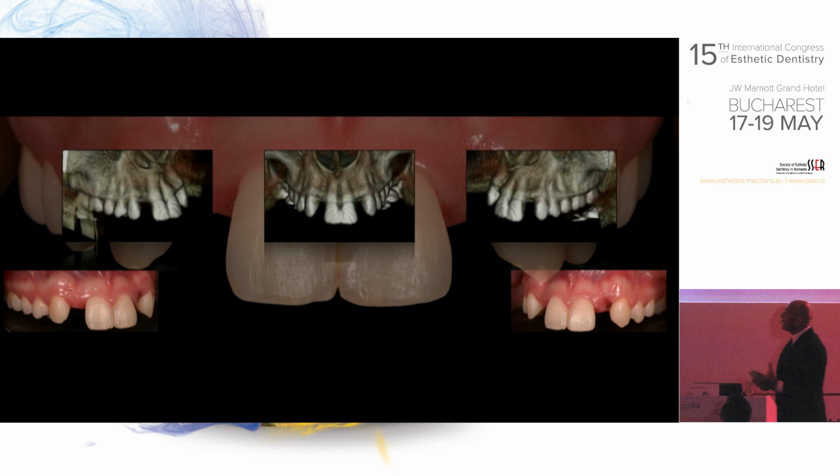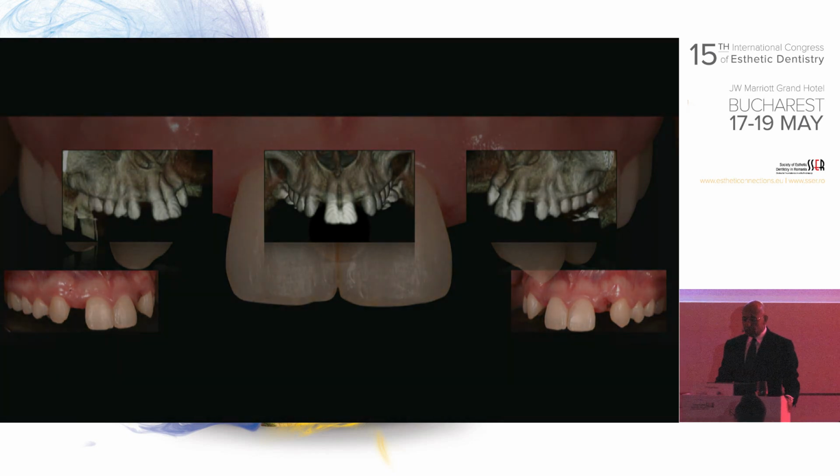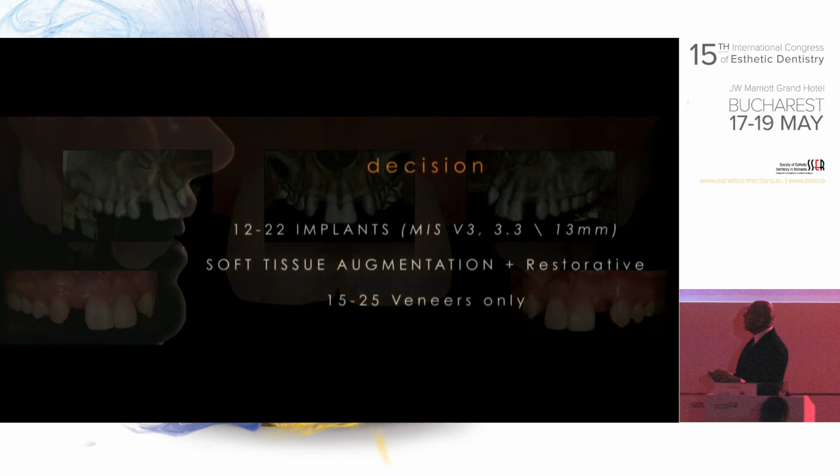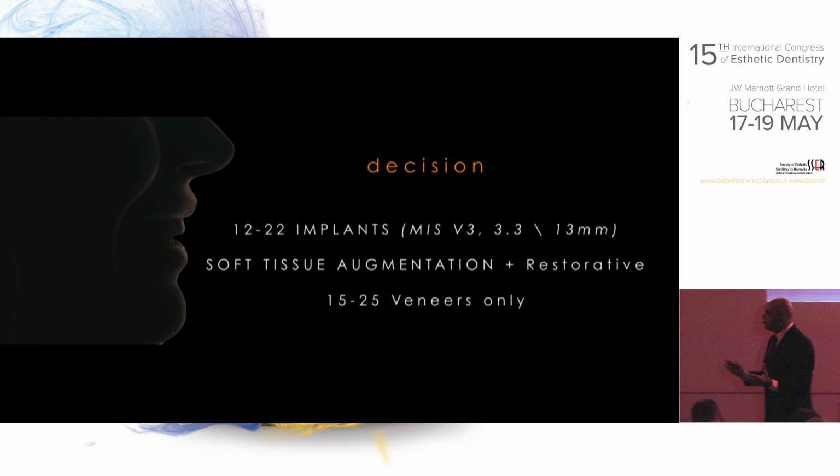And we can see that there is a huge bone loss on both laterals, depression. The lucky part we had was that vertically we had enough bone, because horizontally there are so many ways to recover it. So after the whole team discussion with Skype meeting, the decision was that we will be placing 2 implants on the laterals.